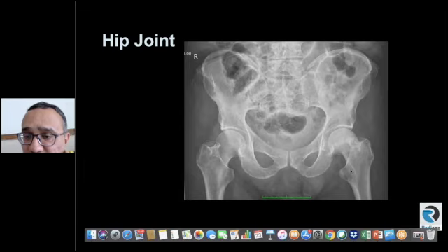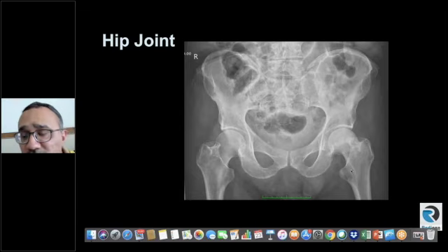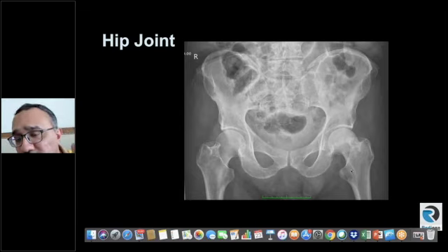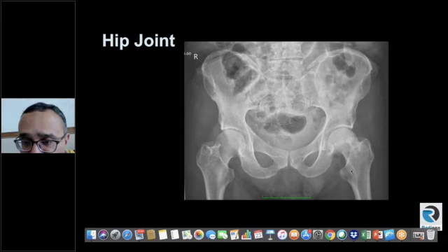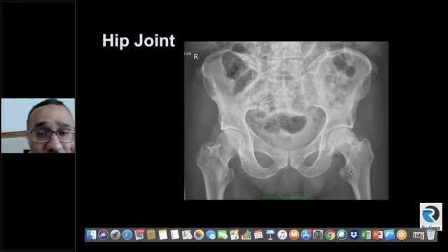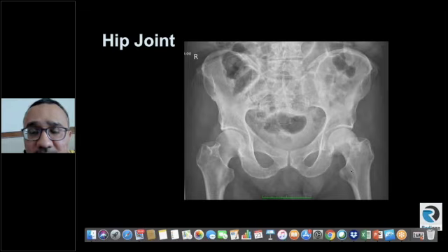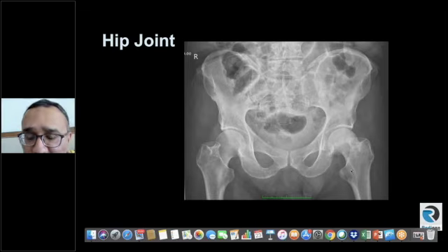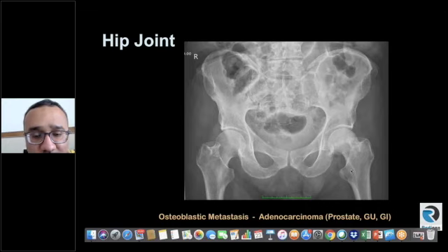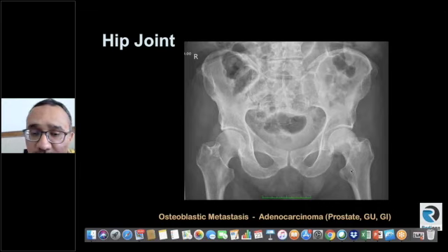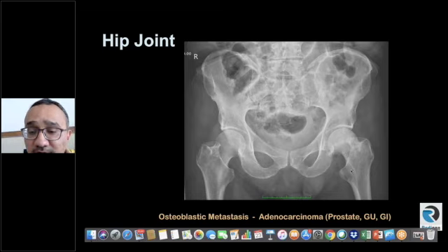In an adult patient, diffuse sclerosis of a bone — why can't it be an osteoblastic metastasis or a primary lesion causing reactive sclerosis? When you see diffuse sclerosis of the femoral head in an adult, don't forget osteoblastic metastasis. Look around for any other focus on the film. This patient had prostatic carcinoma, so osteoblastic metastases — don't forget them. They are usually from adenocarcinoma, whether from the prostate, genitourinary tract, or GI tract.